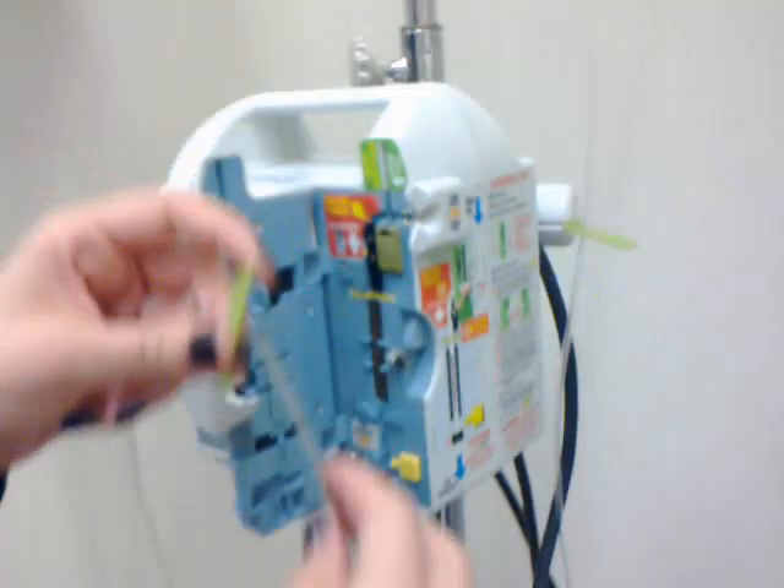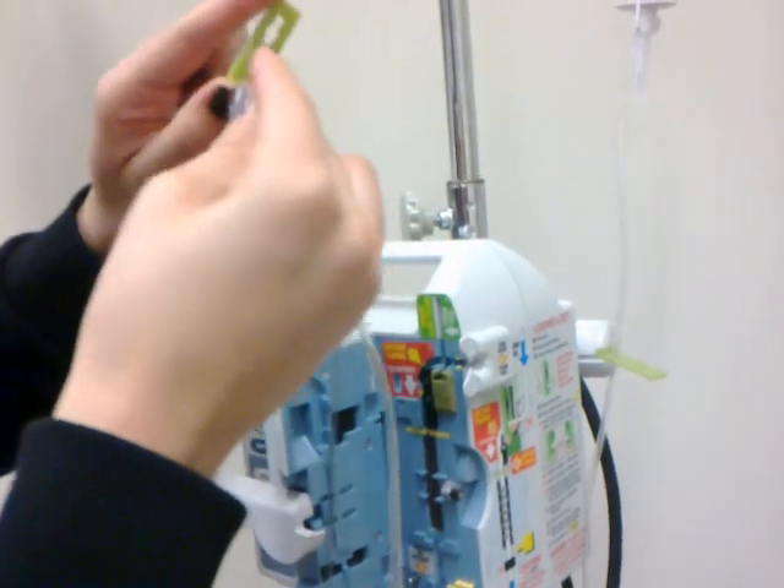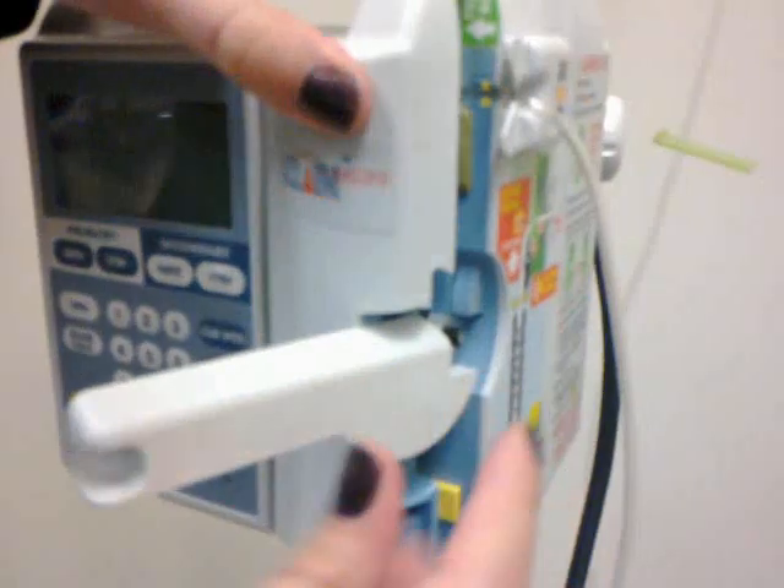First, clamp it. Then where the green thing is, push it in and slide it in, and the lines have to go into the pockets right there, so it'll go like that. Make sure the line follows it down and put it in there, then close it.